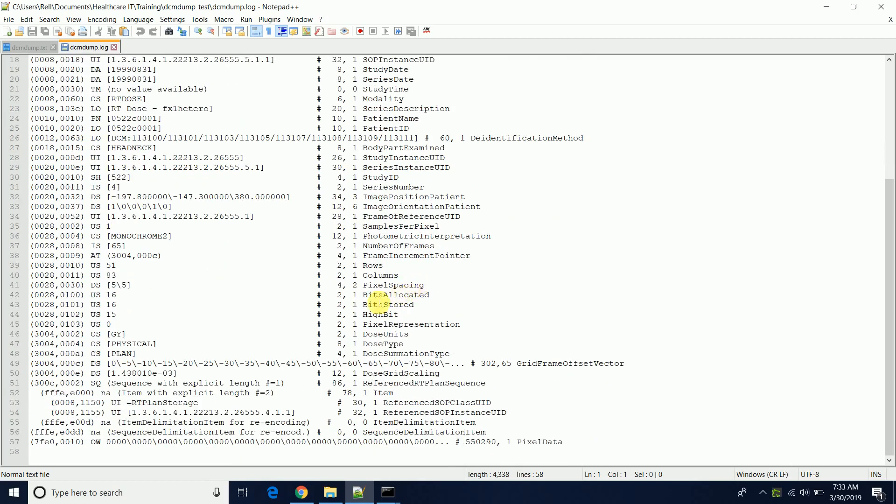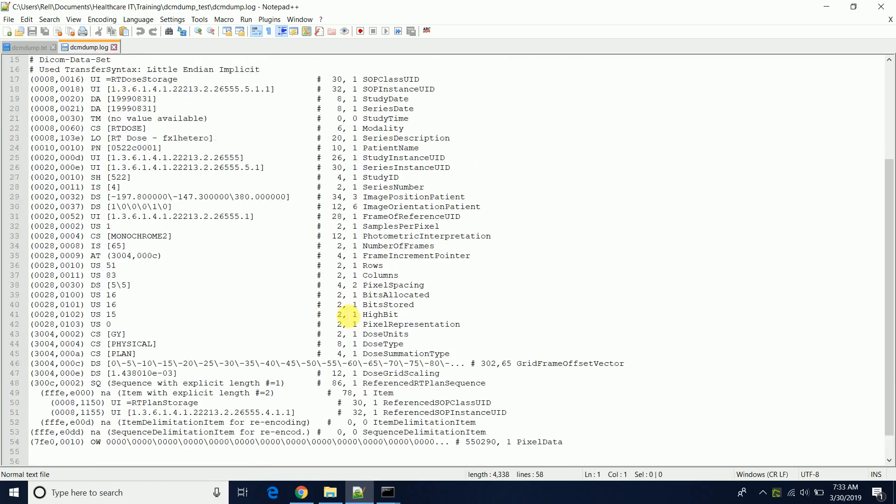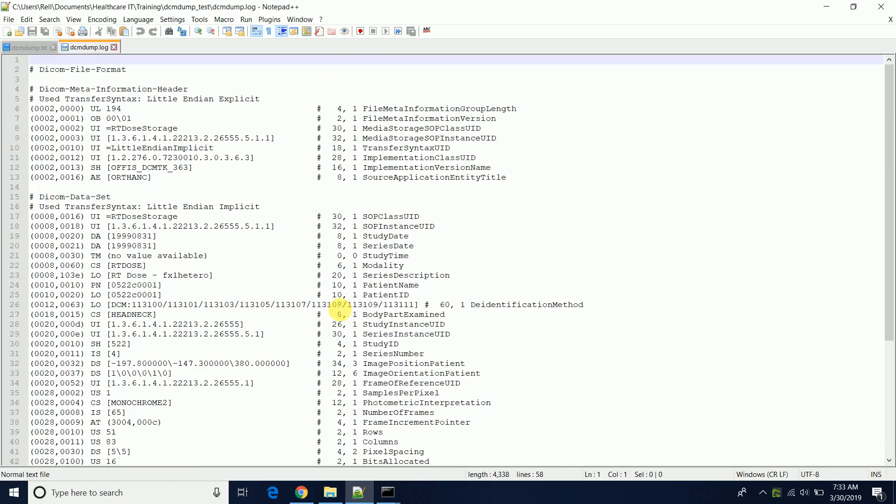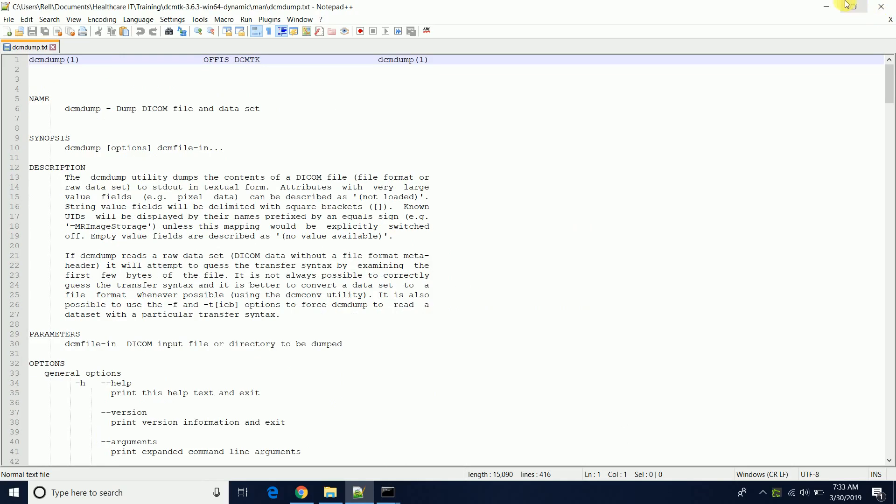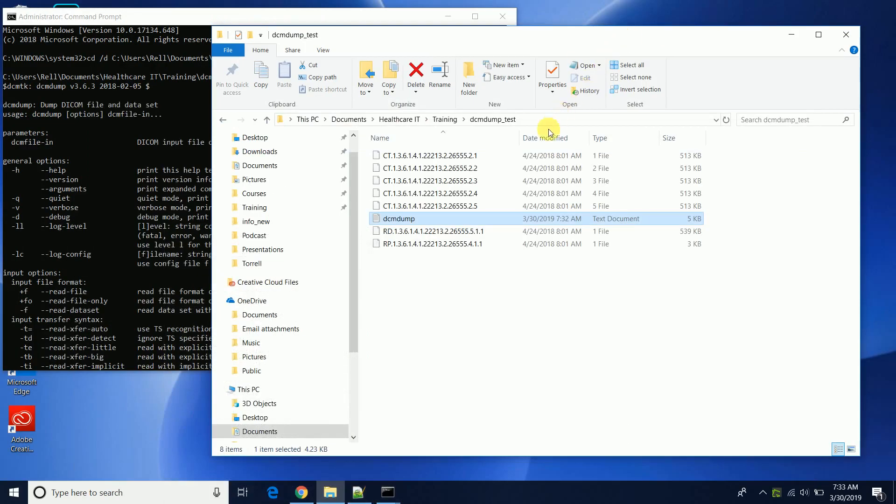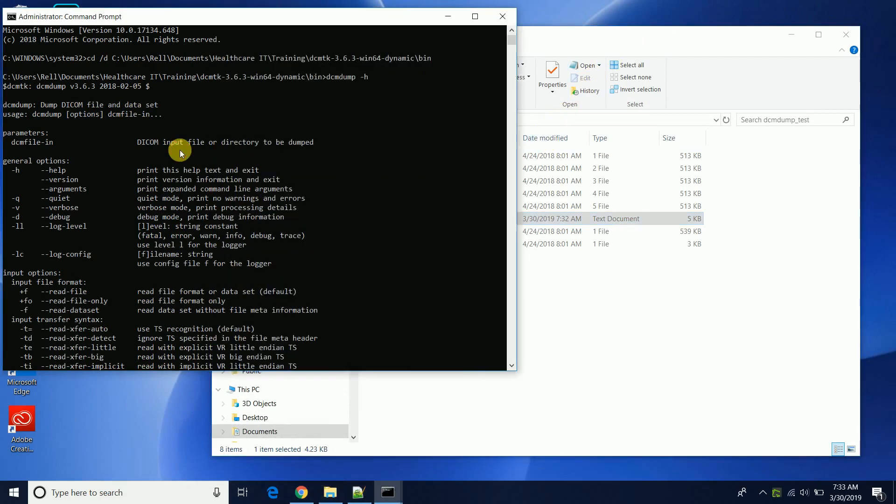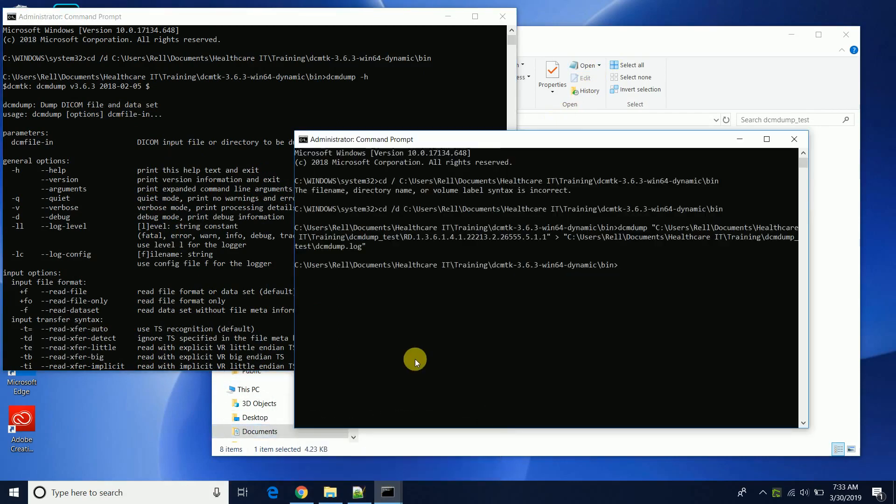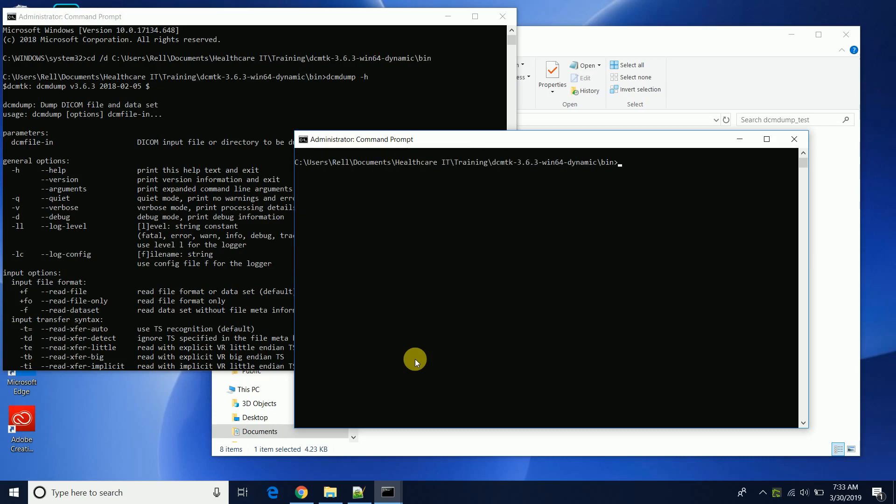So you'll see now if we wanted to actually view all of the DICOM images, the contents from all of the DICOM files in this directory, we would just come back to our command prompt, clear screen, and then of course we wouldn't specify one file, we would just do the entire directory.